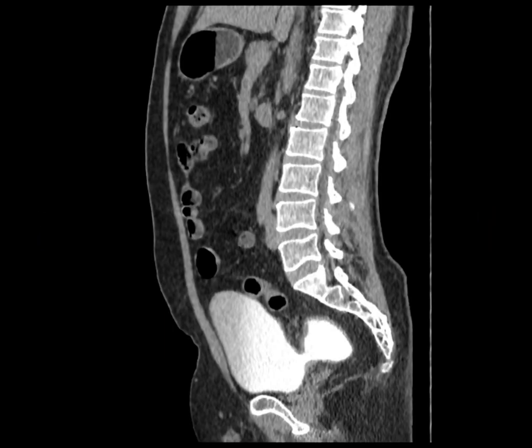Here we can see a CT examination of the abdomen and pelvis with sagittal reconstruction. This is a post contrast image. We can see contrast in the urinary bladder and a solitary prominent sized diverticula is appreciated along the lower portion of the posterior wall of the urinary bladder.